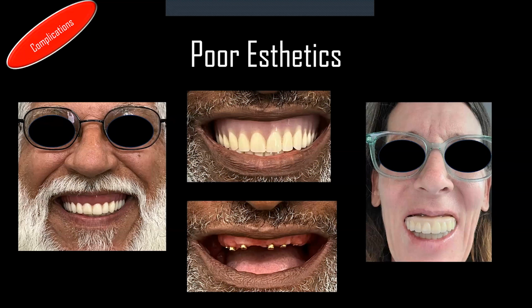They want their teeth back, whether it's a denture that's falling out, or they have neglected their dentition and want to kind of start over. But it's our job as a clinician to ensure that we have adequate space and work backwards with a top-down treatment plan, we like to call it, where we figure out where the teeth need to be and then we work backwards and figure out where the implants are.